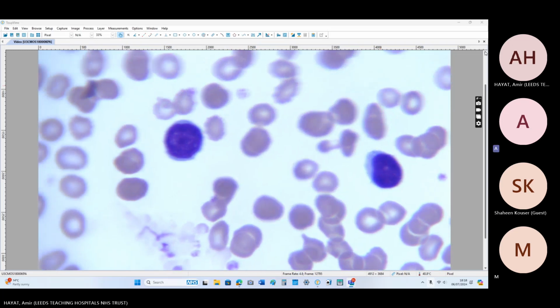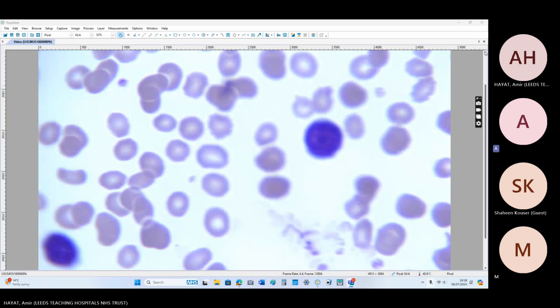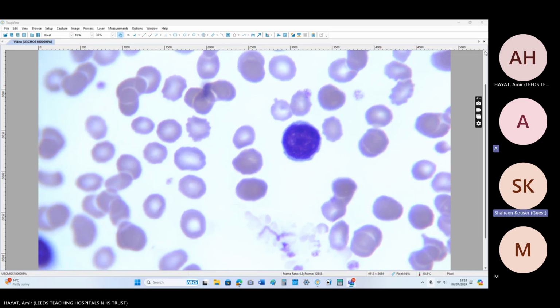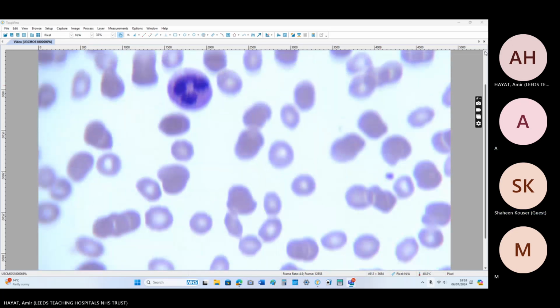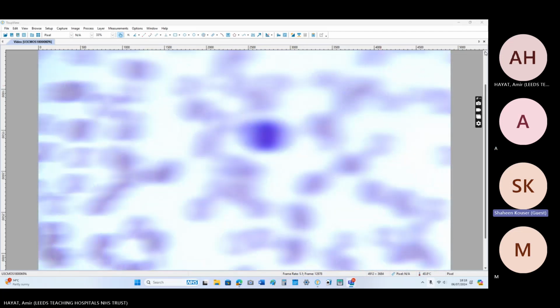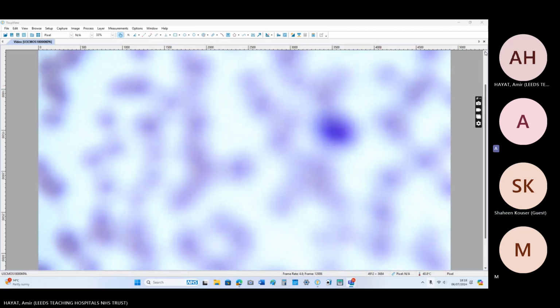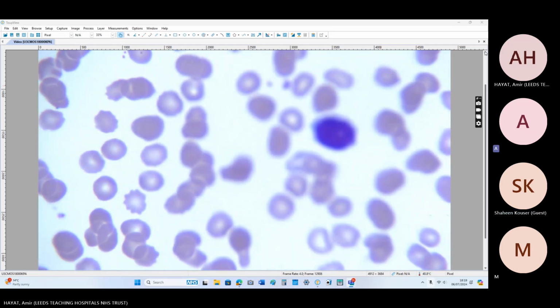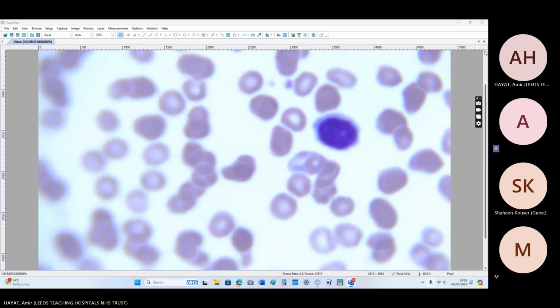Okay, I will repeat whatever I said. There's lymphocytosis, which are small to medium size with abundant cytoplasm in few, and nuclear chromatin is quite clumped. Nuclear contour is regular. Few cells still show, I don't know if it's an artifact or hairy cell projections.